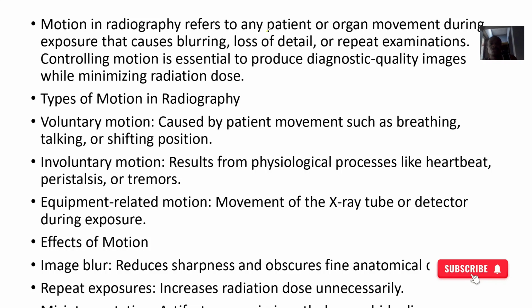To get good images. But if the patient is doing it without your instruction, it could lead to a blurred image, a lot of lost detail on the image, and more cases where you did an image but it wasn't clear, so you have to do it again, thereby exposing the patient to more radiation.